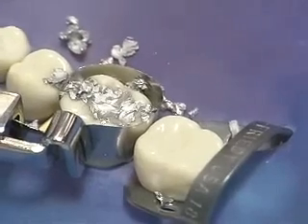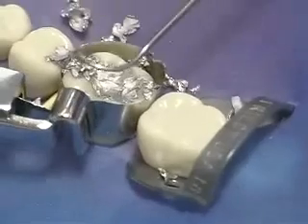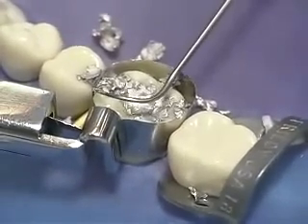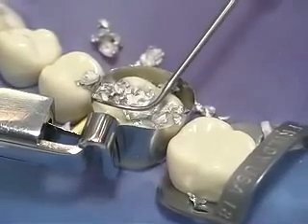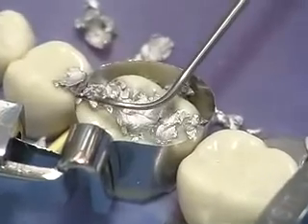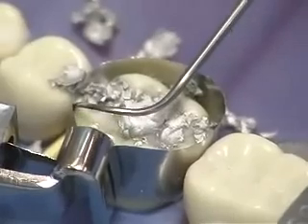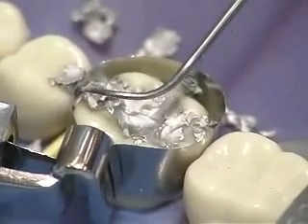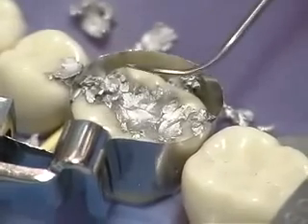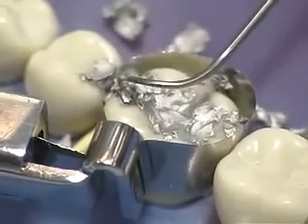Immediately after completing condensation, use the explorer to separate the newly condensed amalgam from the matrix band, to define the contact area and marginal ridge, and to define the occlusal embrasure. This is done by resting the tip of the explorer against the matrix band and moving the explorer from the lingual proximal margin toward the buccal, stopping at the center of the box. Repeat this procedure again, this time starting from the buccal proximal margin.